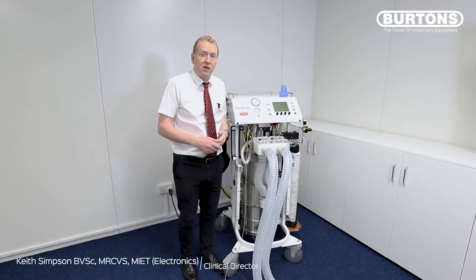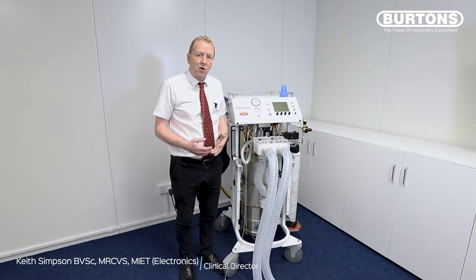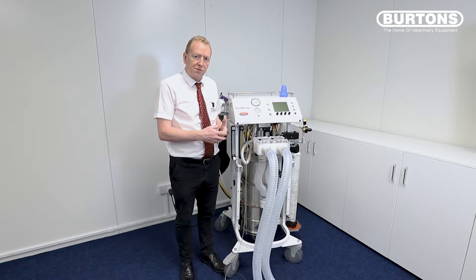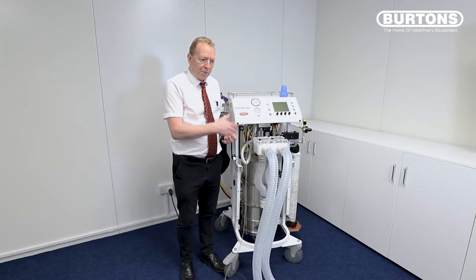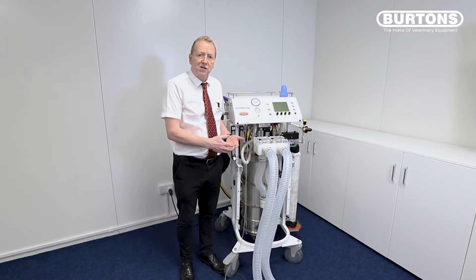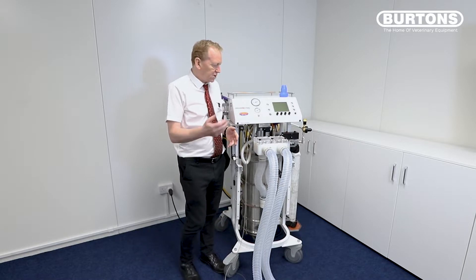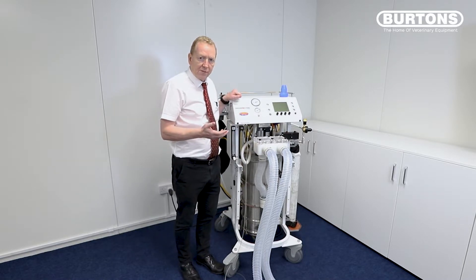Hello and welcome to this video on the Tofonius Junior. This is a quick test setup and run video where I just want to go through the setup of the Junior — basically how it performs, how you initialize it, do your leak test, set it up and then get going. So it can be a short instructional video and we'll start with a little concept about the machine.